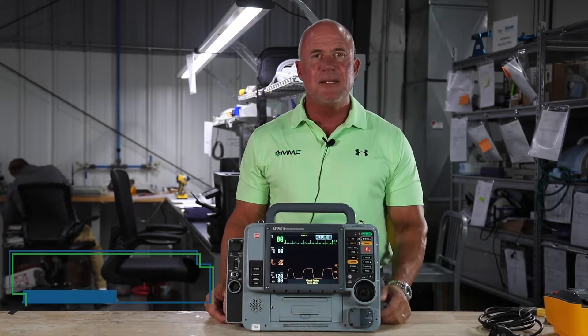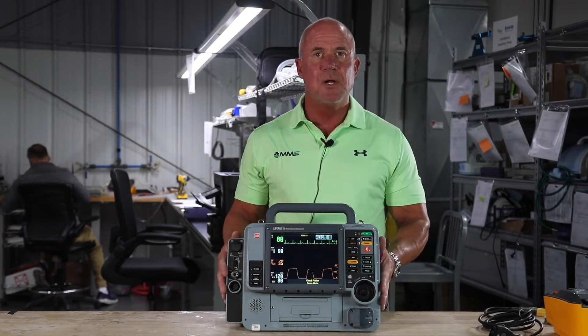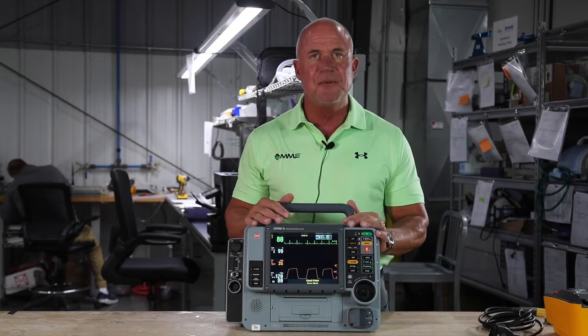Hi, this is Mitch. I'm with Master Medical Equipment, and today I'd like to talk to you about one of the options that we have available for you: a high quality recertified LifePak 15 monitor.